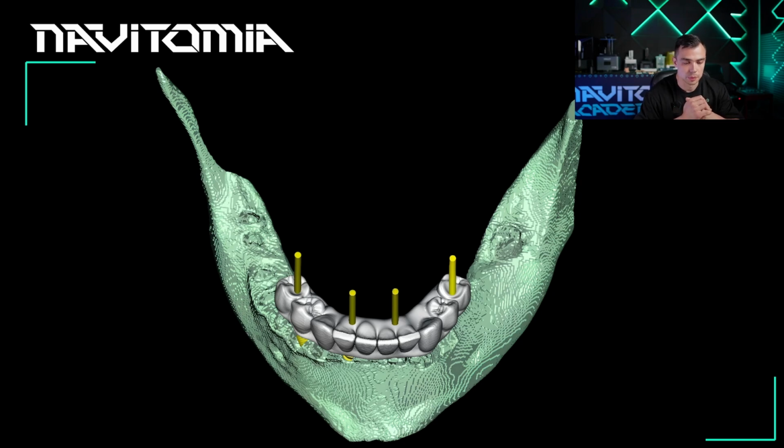and how they should be performed. As you probably know from prosthetic dentistry, the accesses are quite important because they affect the successful fitting of the prosthetics, because ideally, like in this picture, the axes of the implants have to be absolutely parallel, so the fitting, let's say, will be passive.